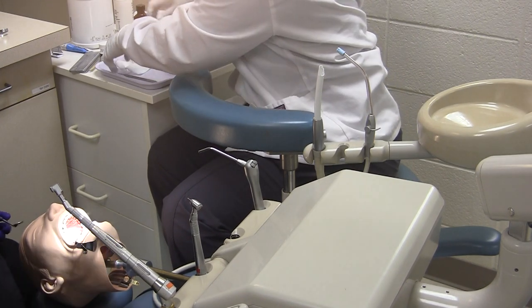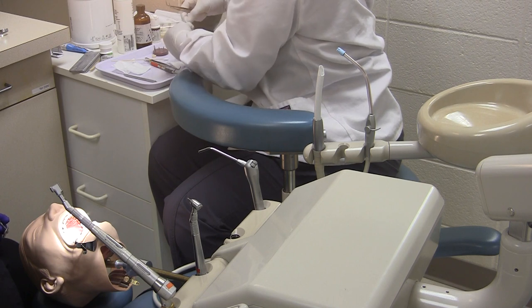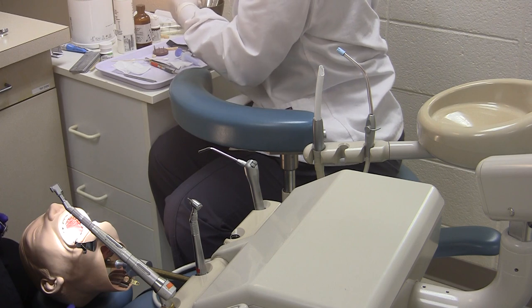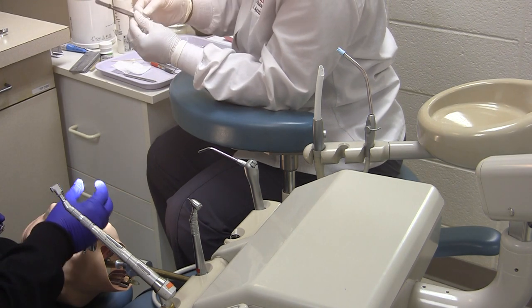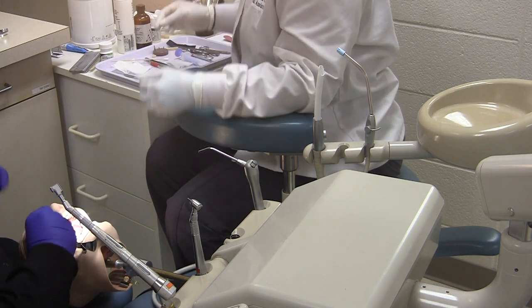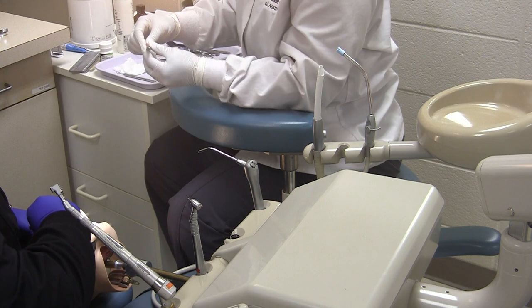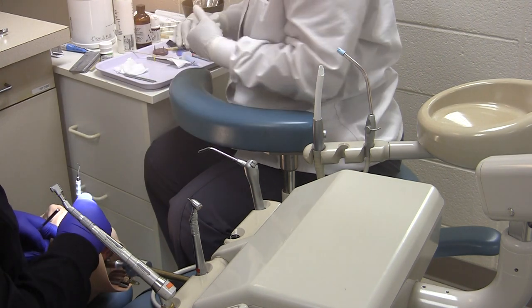After the crown prep is made, the assistant will then prep the retraction cord and pass it. Keep in mind this is an expanded function and some dentists do allow the assistant to perform this.